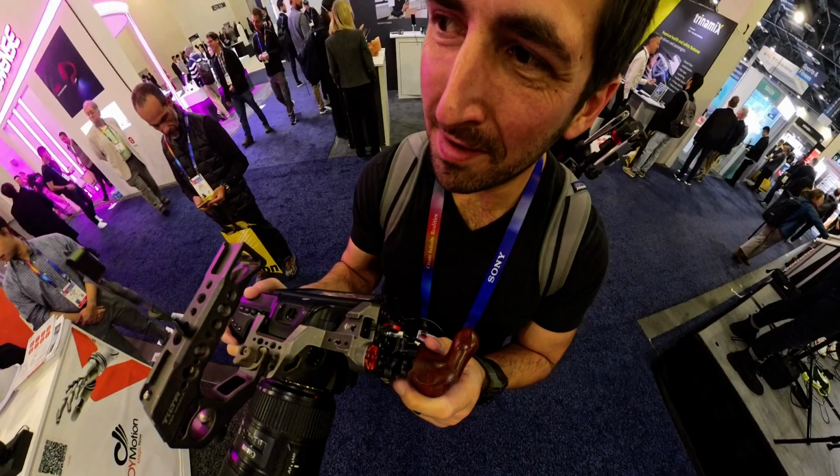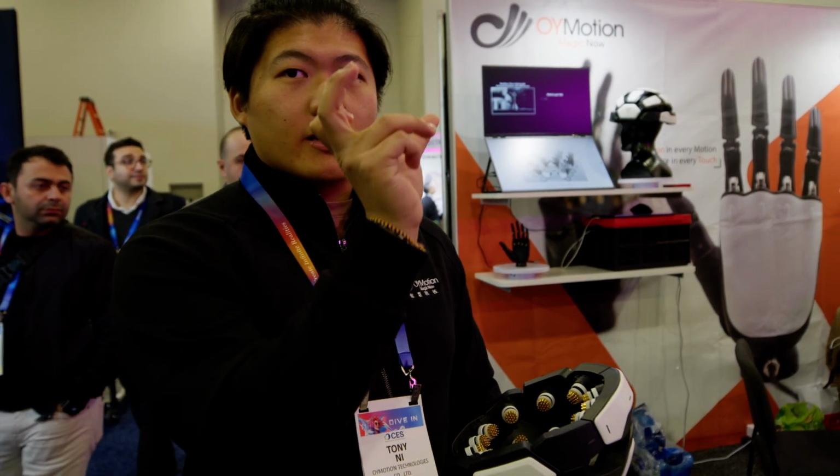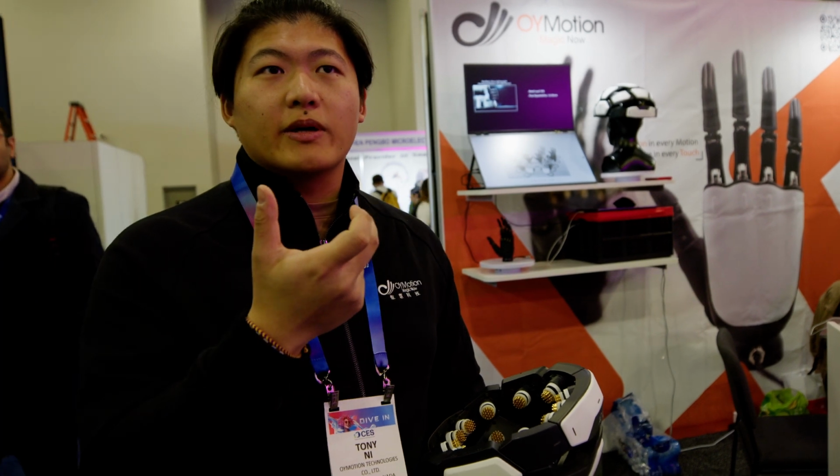Does it need to calibrate to your head? So everyone's brain is different, right? You and I, we have different brains. But at the end of the day, you get the data and transform it into a frequency, and that's pretty similar person to person. So there is a normative data set on the brain, but obviously our brain's changing all the time.